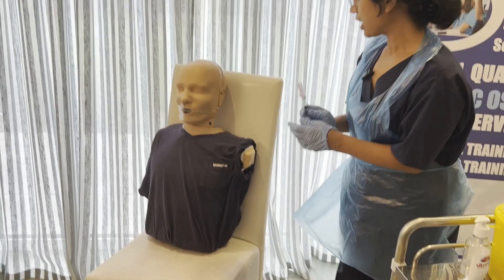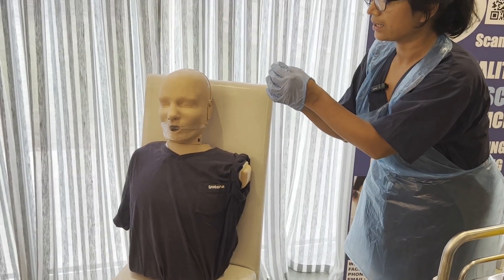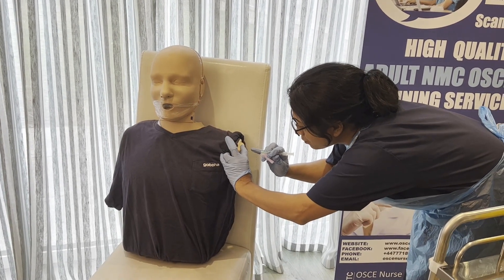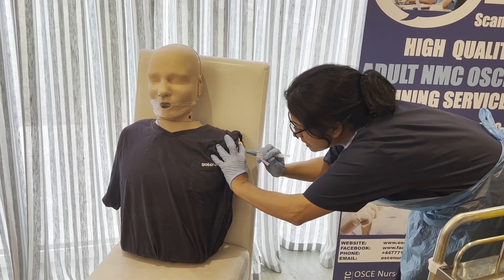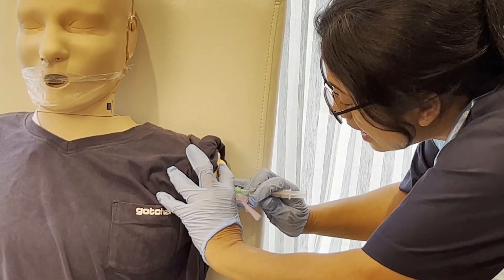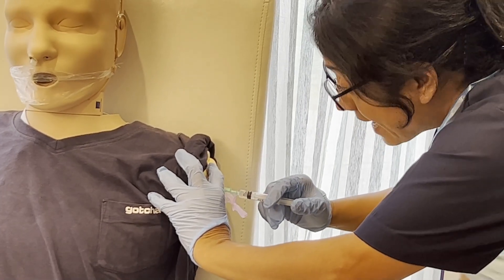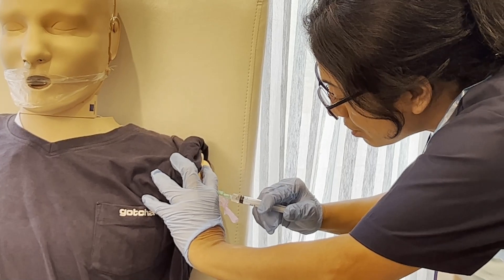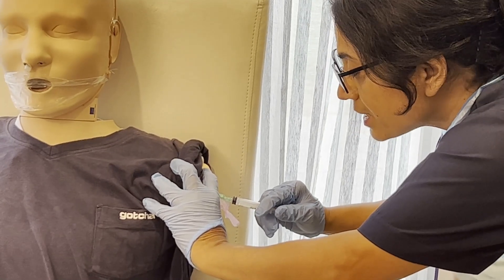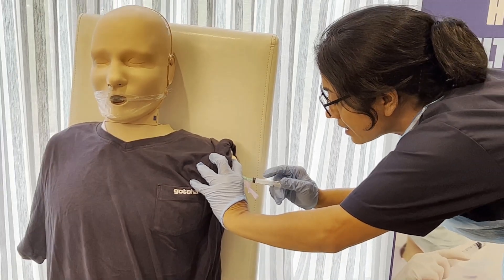We're ready to give the injection. I'll tell the patient 'sharp scratch coming.' Take the safety shield down and remove the cap. Stretch the skin and insert the needle at 90 degrees, two to three fingers below the acromion process in the deltoid muscle. Leave one centimeter visible. No need to draw back for blood in the deltoid muscle. Administer over 10 seconds: one, two, three, four, five, six, seven, eight, nine, ten.